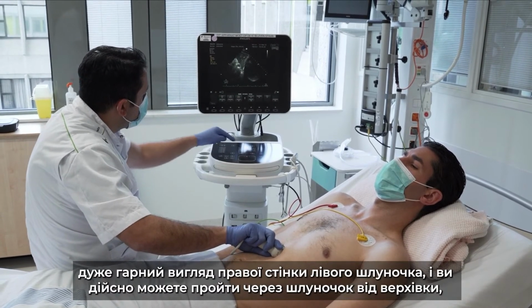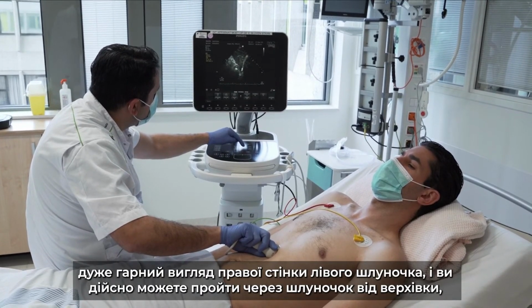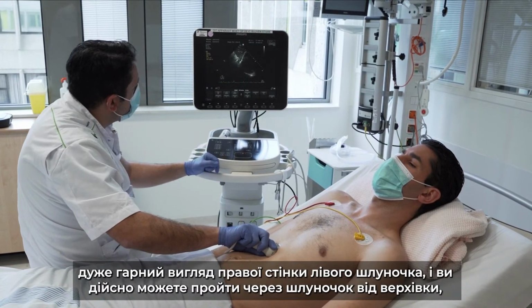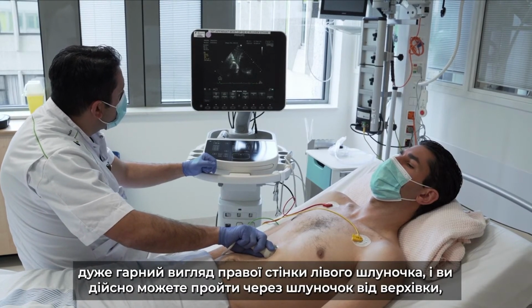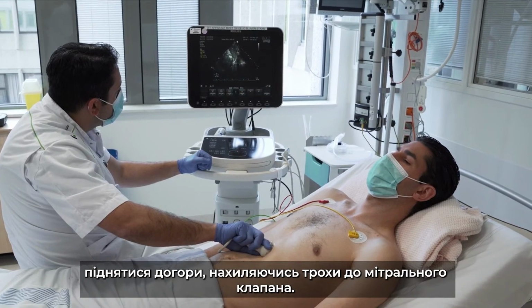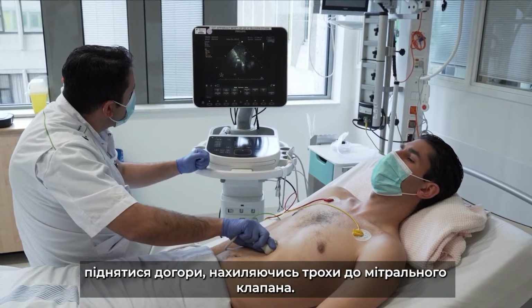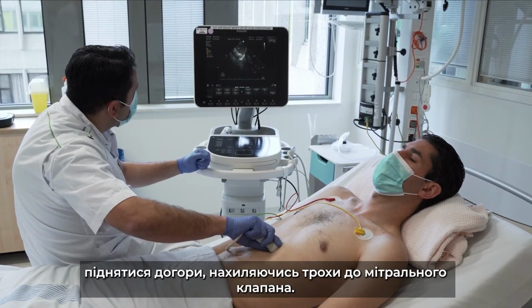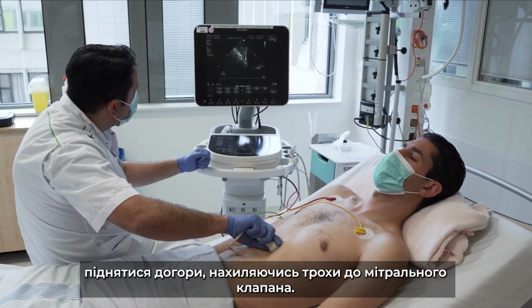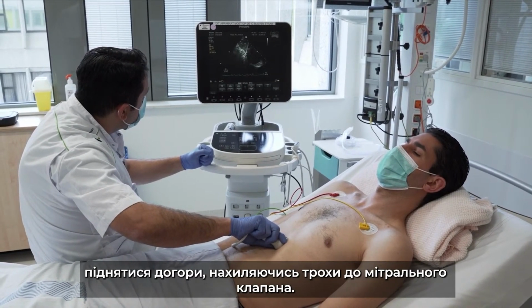This is a very nice view on the right side of the left ventricle, and you can actually walk through the ventricle from the apex. So this is really the apex, and you can go upwards by tilting slightly towards the mitral valve, and I think the mitral valve is coming now.